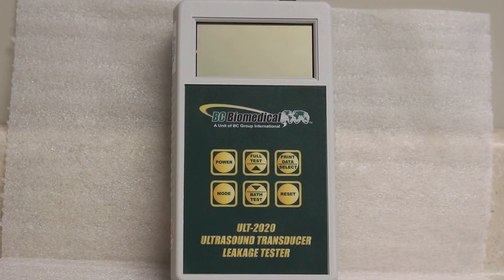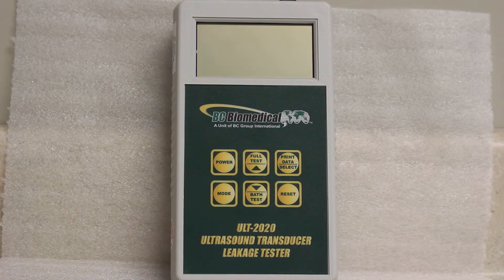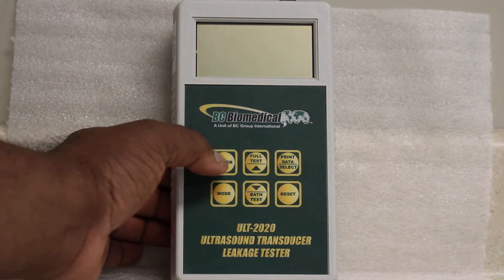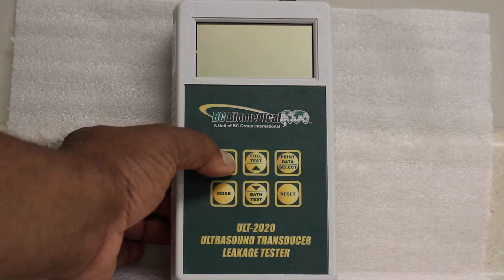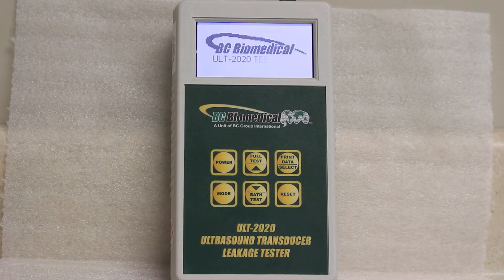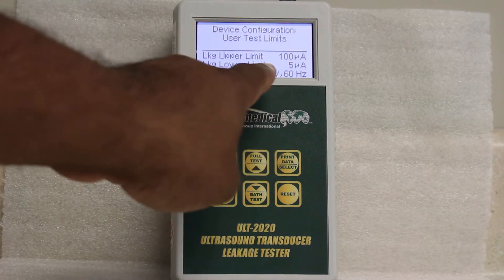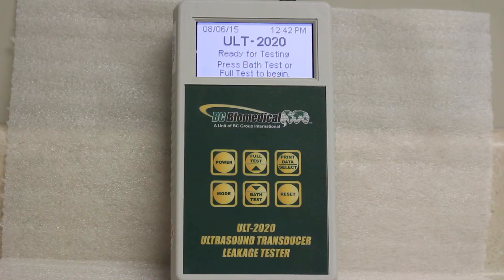This video shows you the steps to change the default settings of the user configuration on the BC Biomedical Leak Tester. You first turn on the leak tester and you'll see it's the user test limits, and it shows you the limits that it's set to.